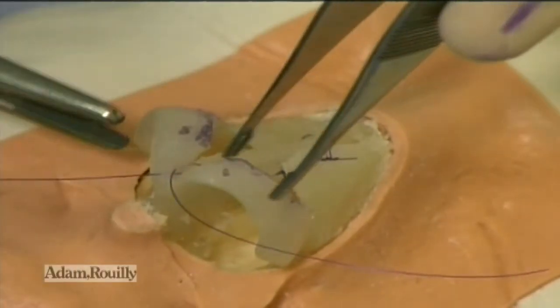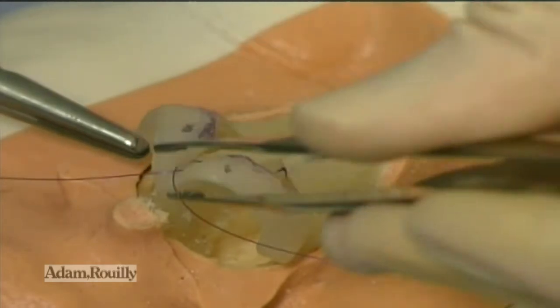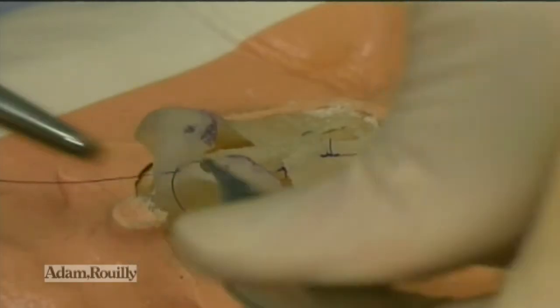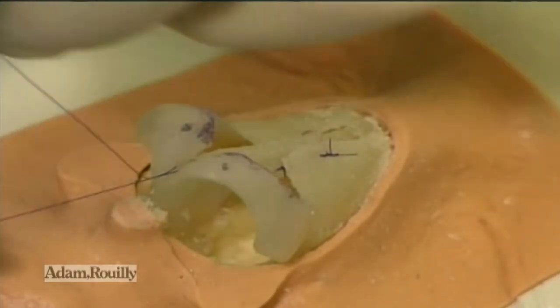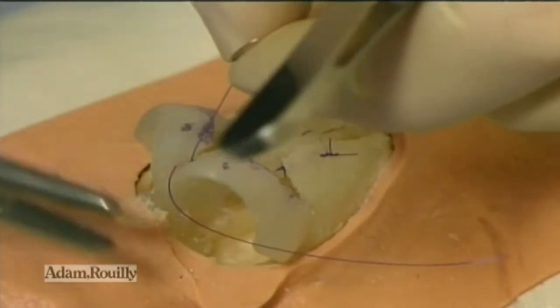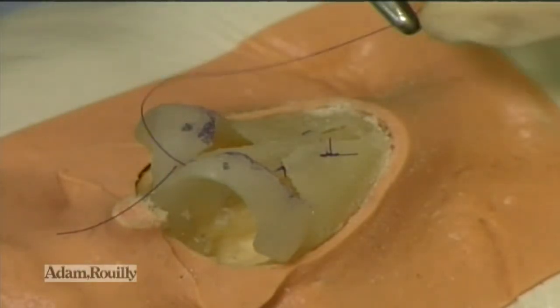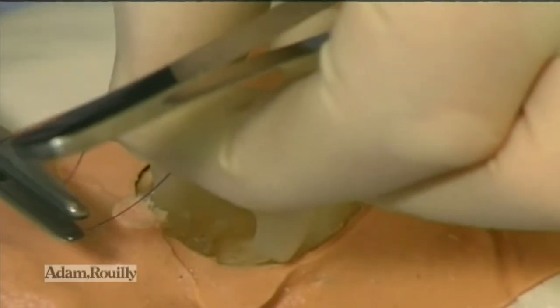We are now going to adjust the domes relative to each other and bring the junction of the medial crura and intermediate crura together with a medial crural fixation suture. Not only does this equalise the heights of the domes, but also unifies the medial crura, making them less likely to move with subsequent sutures.